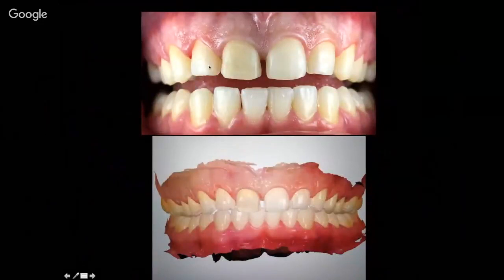From here we can start the cutting in a minimally invasive way. We are in the era of non-invasive dentistry. You can see how thin the finish line is all around the teeth. So, cutting of the upper 10 teeth with minimal invasion and polishing of the preparation. Here we can see the scan after preparation.